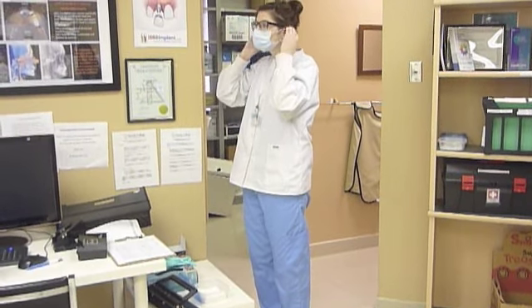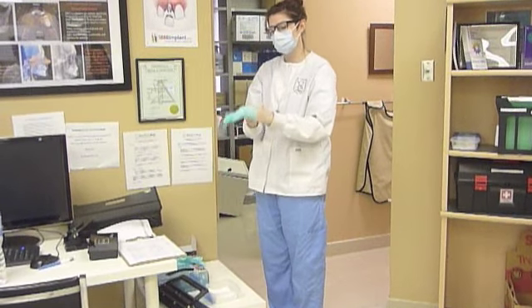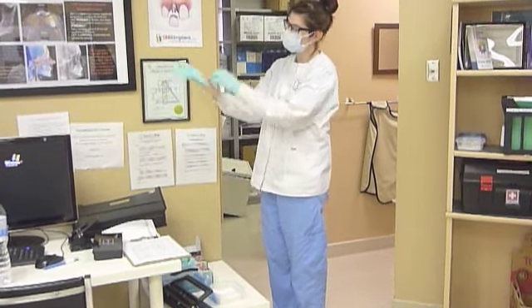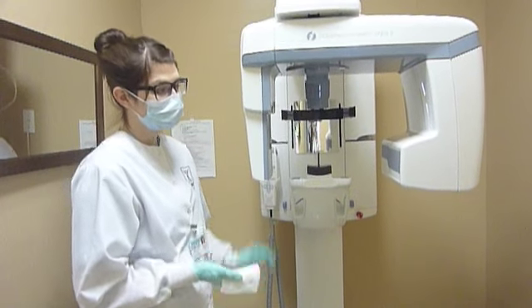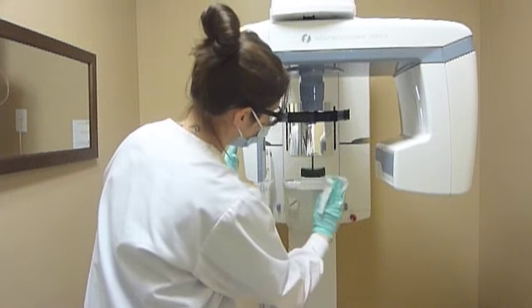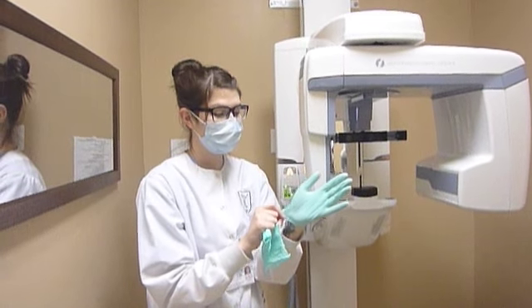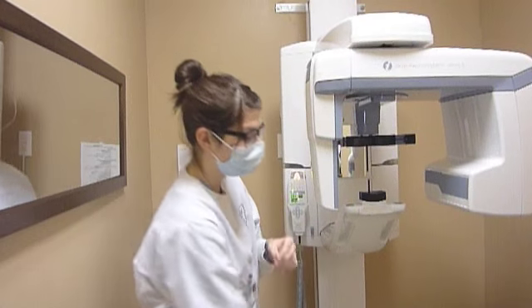To prep the room for the panoramic, the dental hygienist must put on gloves, a mask, and disinfect with a CaviWipe. After the dental hygienist has put on her gloves and mask, she must go into the room and completely disinfect all areas that could possibly become contaminated. After disinfecting the room, the dental hygienist can remove her gloves and mask before placing the barriers.